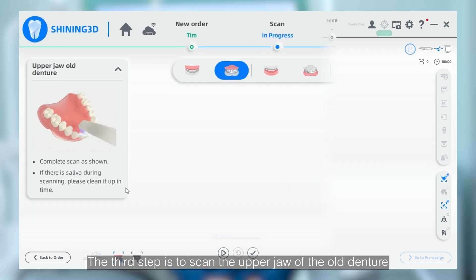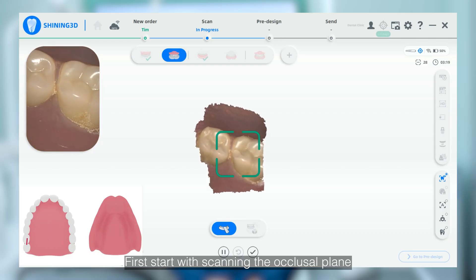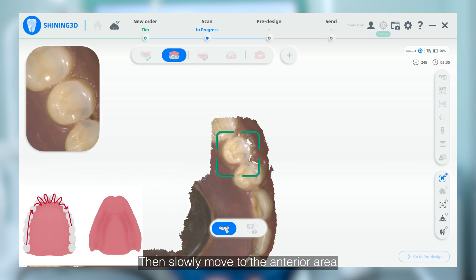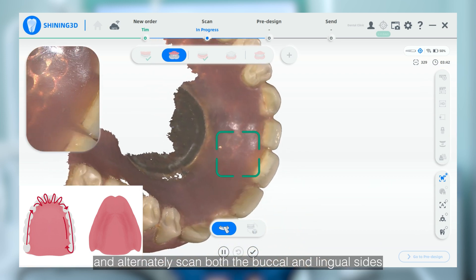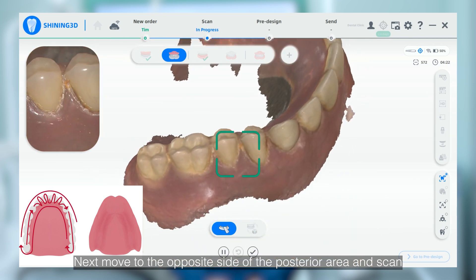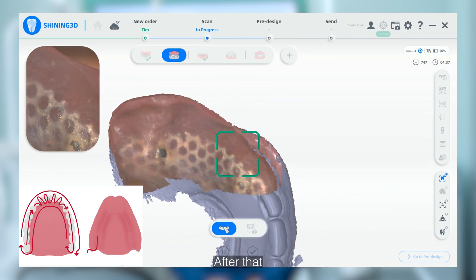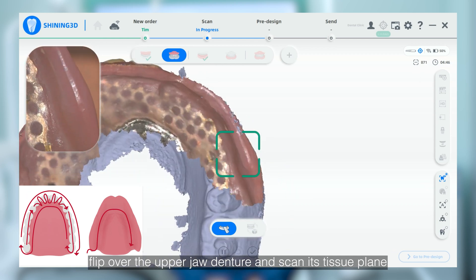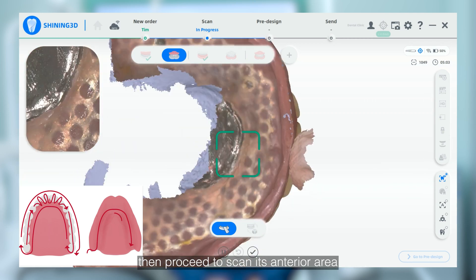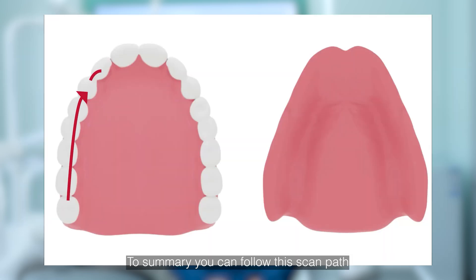The third step is to scan the upper jaw of the old denture, following the guidance on the software as well. First, start with scanning the occlusal plane and capture the occlusal surface of the posterior area. Then slowly move to the anterior area and alternately scan both the buccal and lingual sides. Next, move to the opposite side of the posterior area and scan the lingual side of the occlusal plane before scanning its buccal side. After that, flip over the upper jaw denture and scan its tissue surface. Scan the inner side of the occlusal surface first, then proceed to the anterior area before finishing with the palatal part. In summary, you can follow these scan paths.